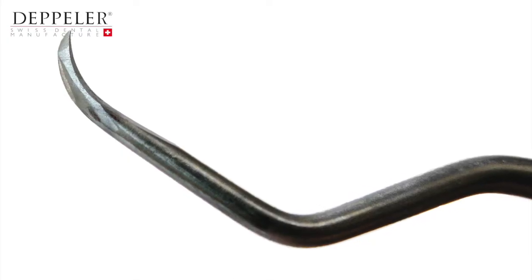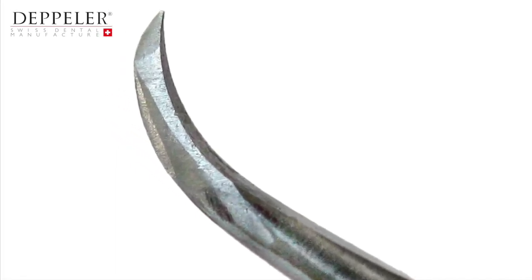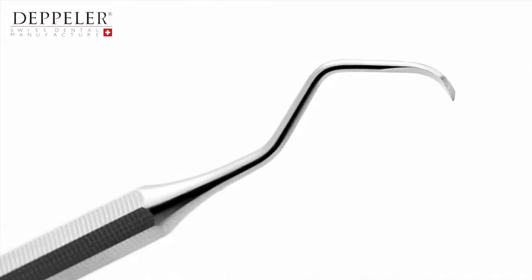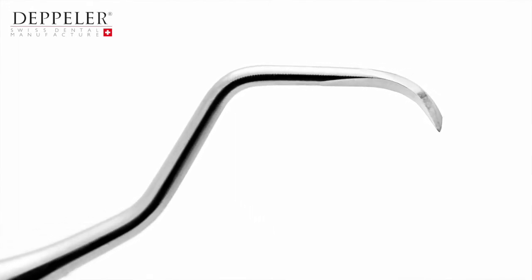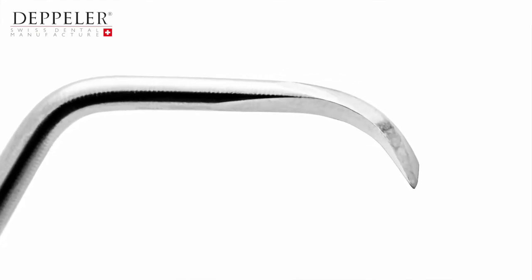Here is an example of poor sharpening. The instrument has multiple facets and the blade's cutting edge is serrated. To you, the blade will appear to be extremely sharp, but the micro teeth quickly become blunt and the instrument must be sharpened more often. After sharpening with the EasySharp, you will obtain this result.